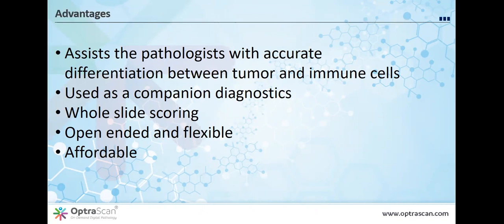So it's calibrated against a consensus of pathologists. It means it can never be better than the pathologists. It can only approach how good they are as consensus. Ultimately, of course, the real test of deep learning image analysis, which is beginning and which this process is a first or second step along the pathway. Ultimately, the image analysis would be set directly against the clinical outcome, and the pathologist, in a sense, would then learn from the image analysis system.